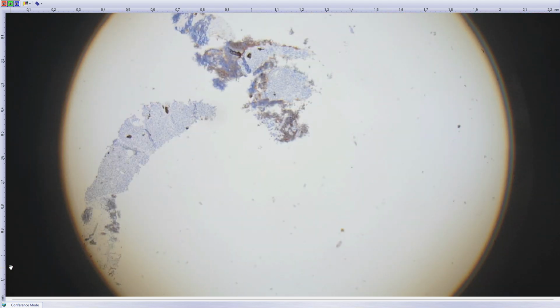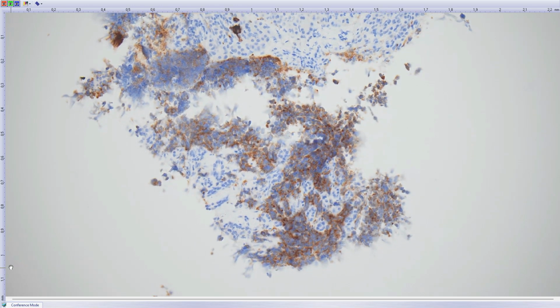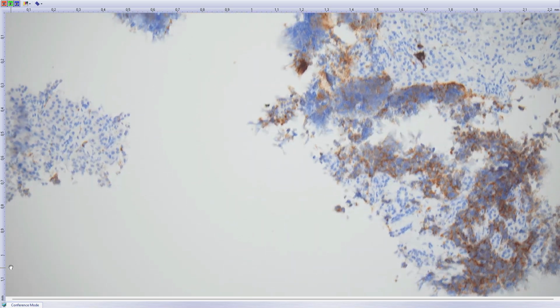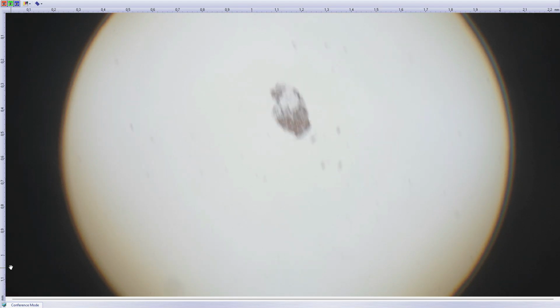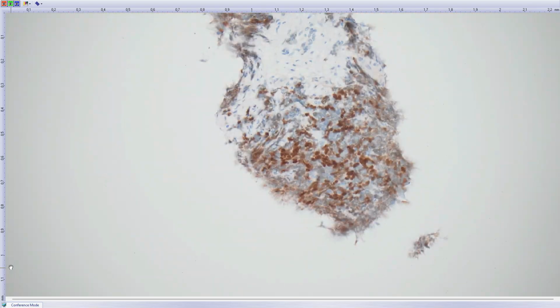And if you wish to see neuroendocrine markers, synaptophysin, I believe, was positive, but could be negative. Up to 4 or 5% of small cell neuroendocrine carcinomas may be negative for your neuroendocrine markers. So synaptophysin was positive, as was P16 staining, which is very good. INSM1 staining was, I believe, positive. Yeah, it's here. So it's small cell carcinoma.